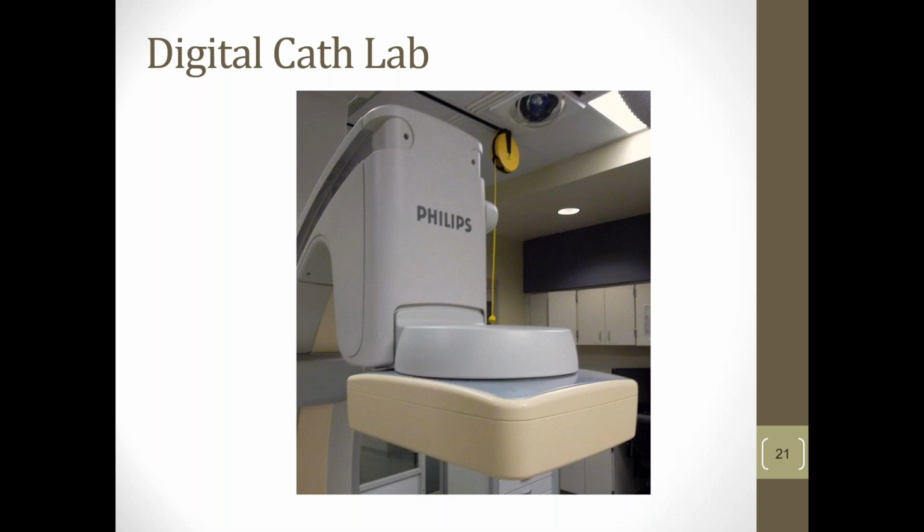Especially the older systems that had the TV cameras in them, the image quality against the first and second generation digital rooms was far superior. Now it's advanced. It's like your old 3MP camera that you had 15 years ago versus what's out now. A film camera did have better resolution in those days than the early digital cameras. It was the same with this. The early digital technology was nice, but really the image quality was marginal compared to a nice, well set up analog system.